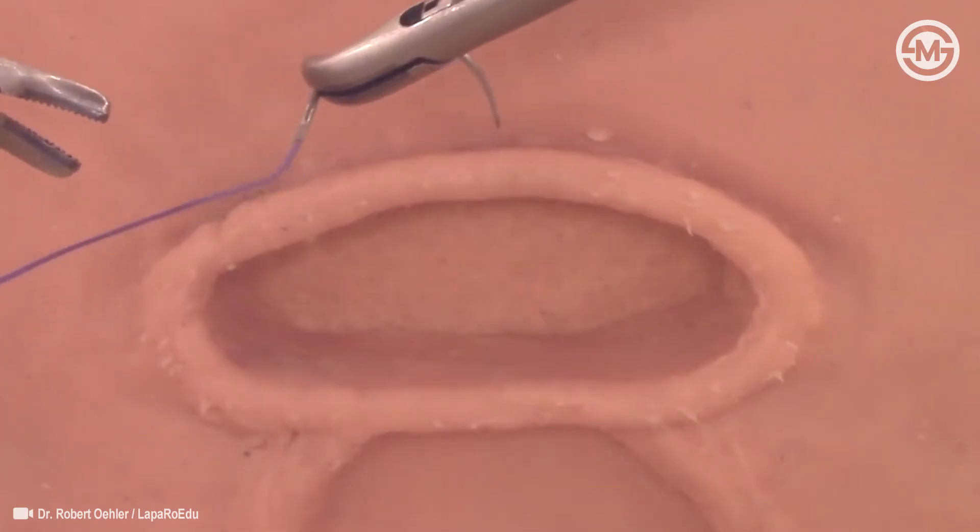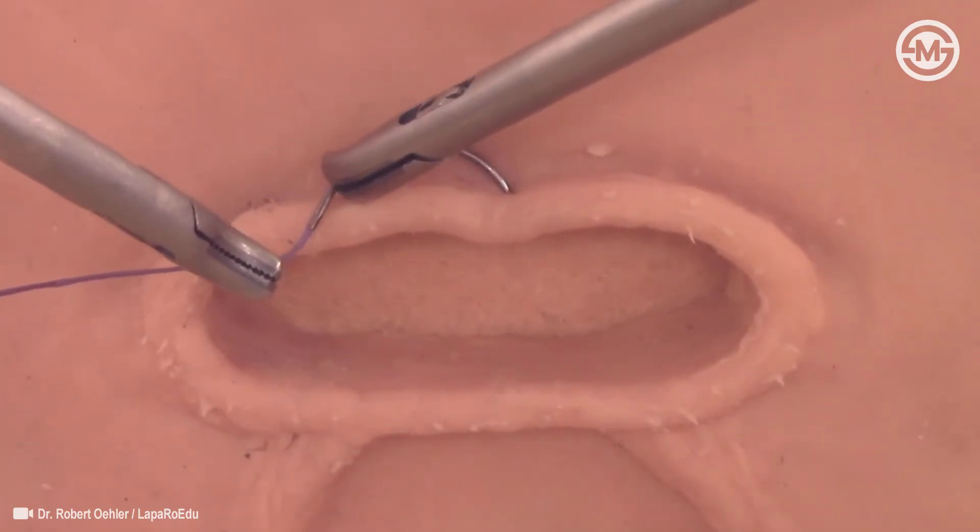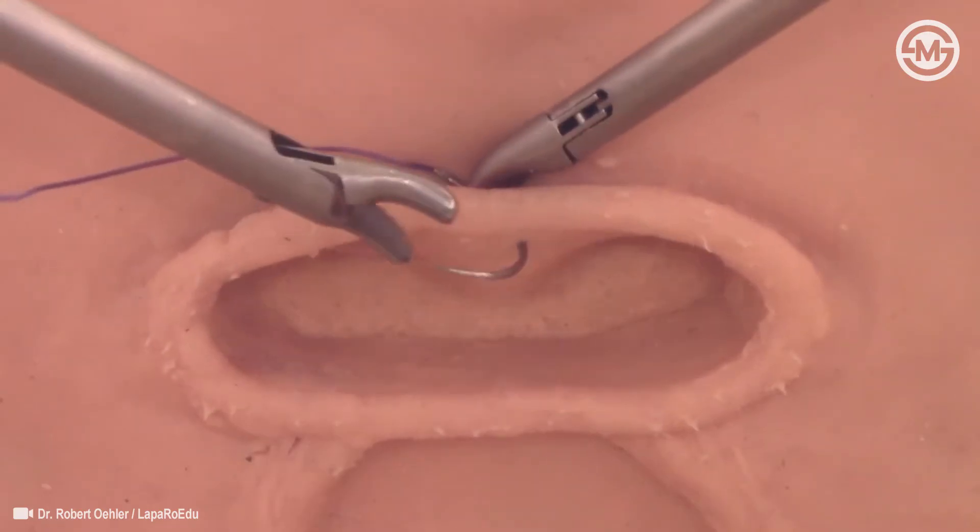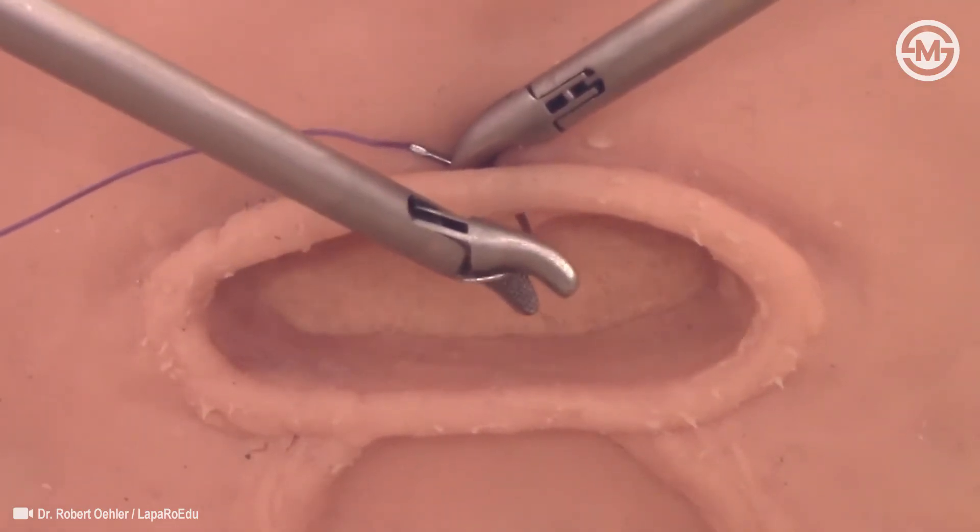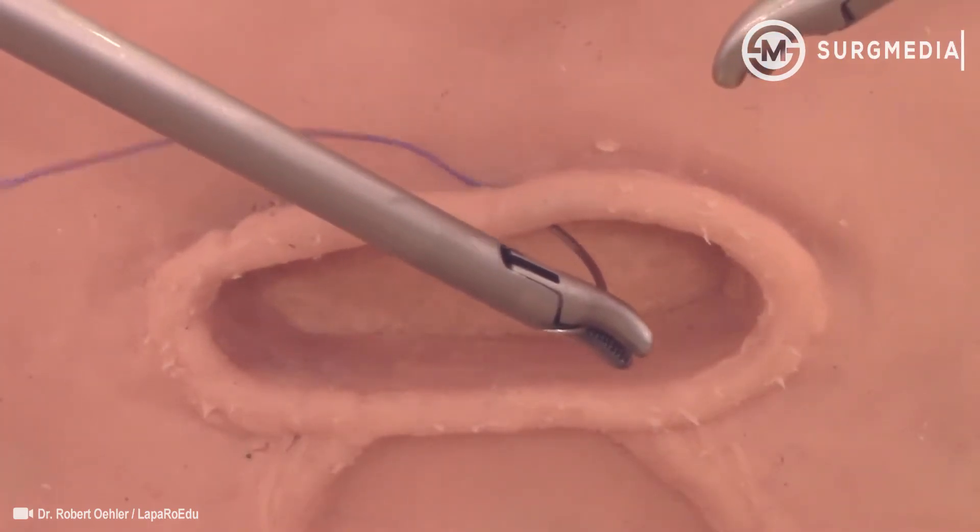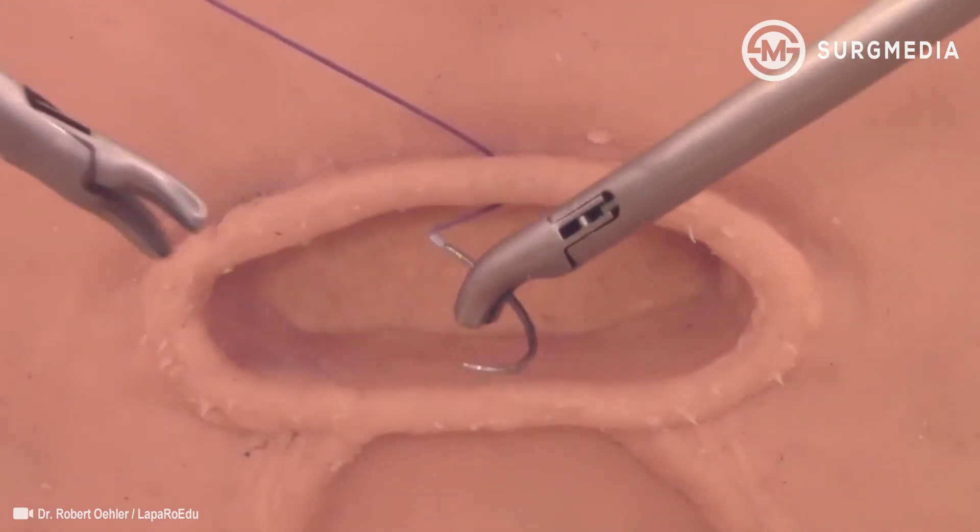The entry angle of the needle tip into the tissue should be 90 degrees. Advancing the needle through the tissue and rotating the needle driver creates a transmural stitch with the exit point in the anterior vaginal skin. Now the left needle driver takes the needle parallel to the needle plane and completes the first stitch. The right needle holder can re-grasp the needle, which will still be in the correct orientation.